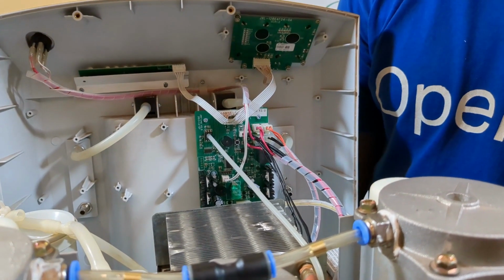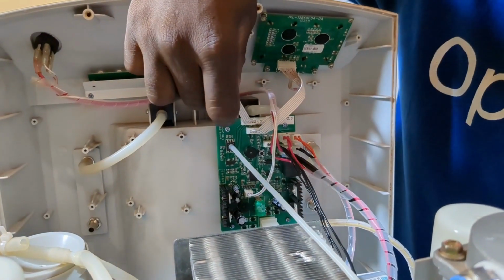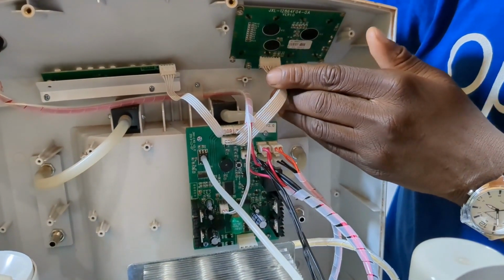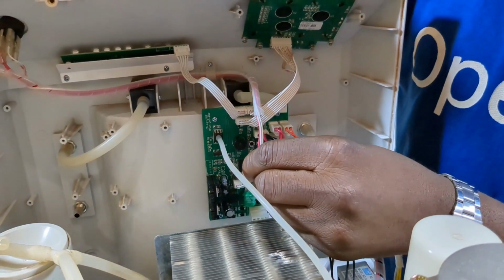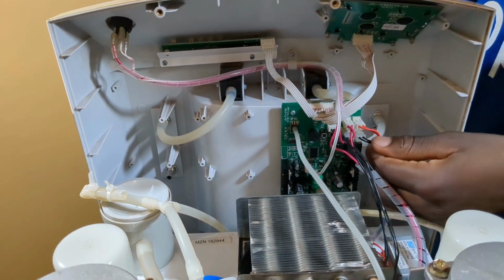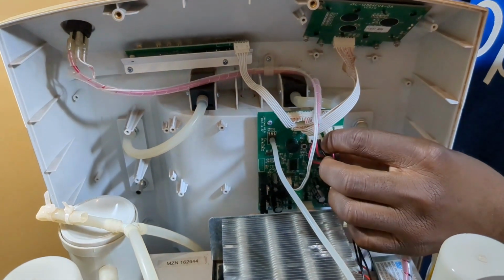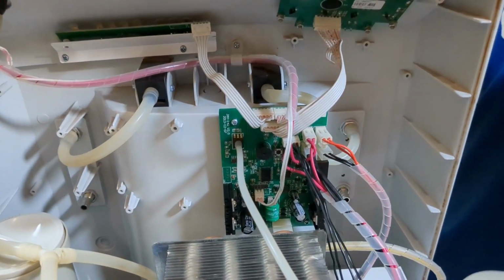So just a recap on what we've talked about. This wire harness goes to the LED indicator lights. These two wires go to the LCD. This one goes to the four-way solenoid valve. This one goes to the switch. These two orange wires go to the transformer. These two small black wires go to the cooling fan. These red wires are coming from the power socket, and these big black wires go to the compressor. And that's all we had for you on the electrical connections of the J5 oxygen concentrator control board.